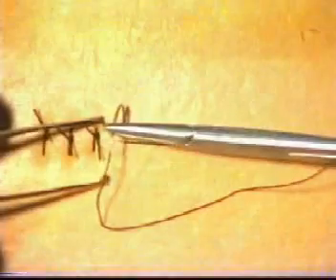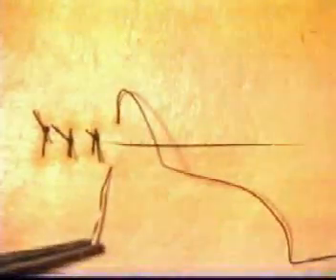When inserting sutures, adopt a 1-2-3 technique. 1, 2, 3. Once again, tie your knot, making sure that it lies correctly without any tension.